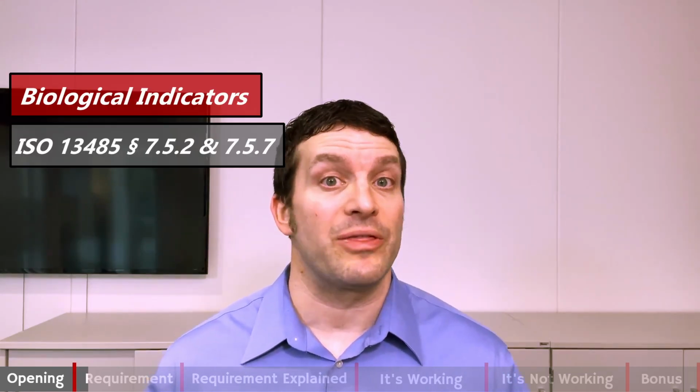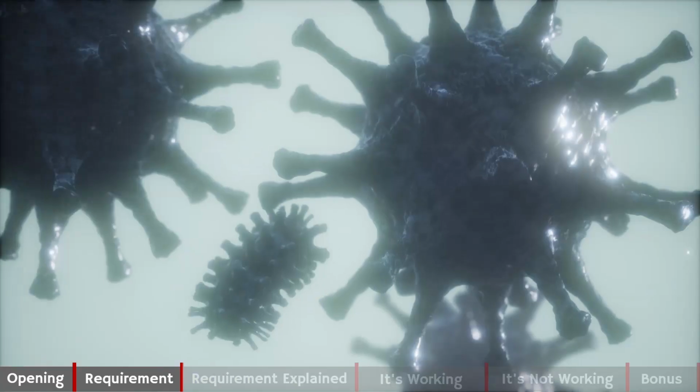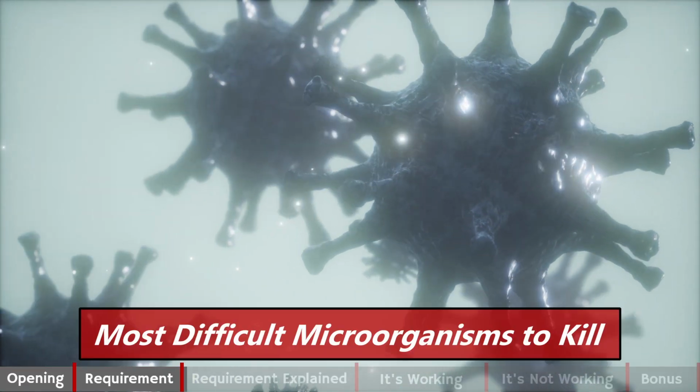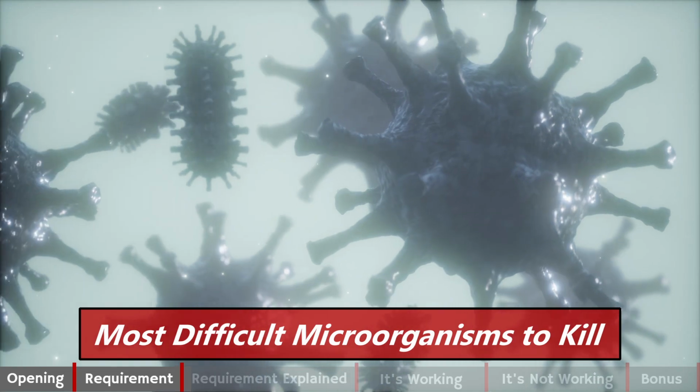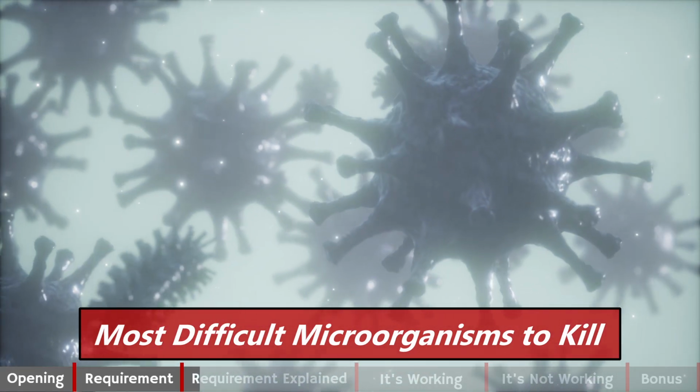Our topic, biological indicators, is covered by 13485 sections 7.5.2 and 7.5.7. There is a standalone ISO standard 14161, Sterilization of health care products, biological indicators, guidance for the selection, use, and interpretation of the results. Biological indicator in 5 words: most difficult microorganism to kill.